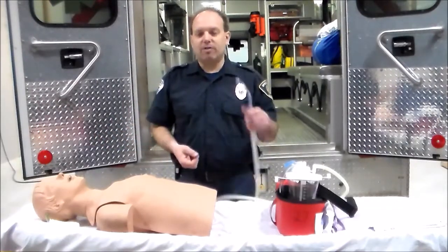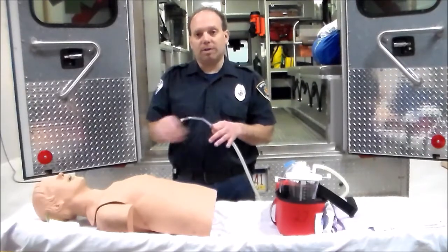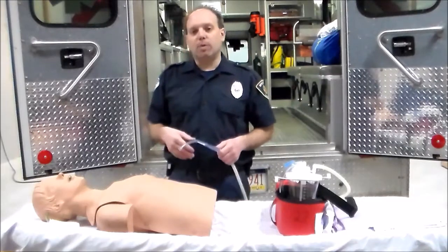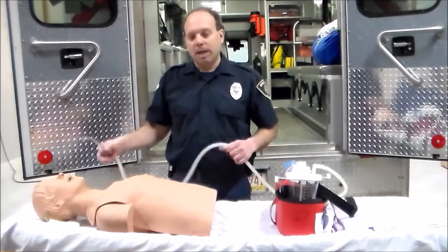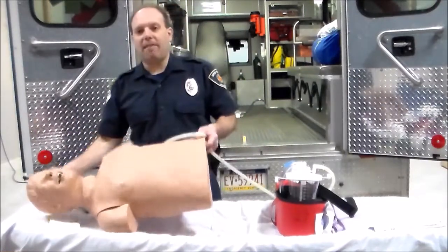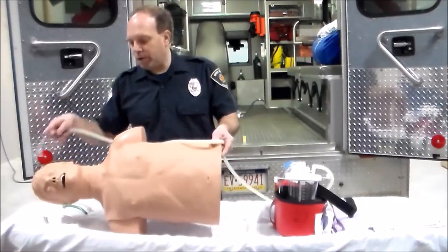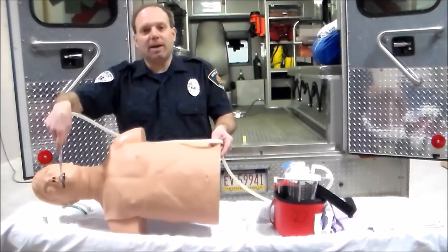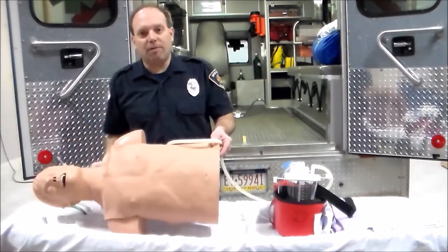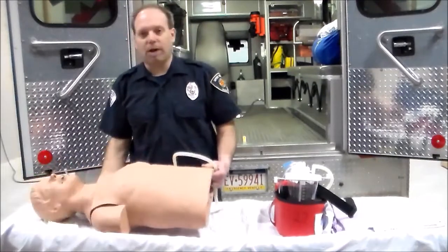There are times to break the rules. We need to suction for as long as it takes to get the airway clear. One of the best things we can do while suctioning is to turn the patient on their side. With them on their side, we support the airway, come in, and suction. Gravity will help us out and we'll be able to suction our patients a whole lot better.